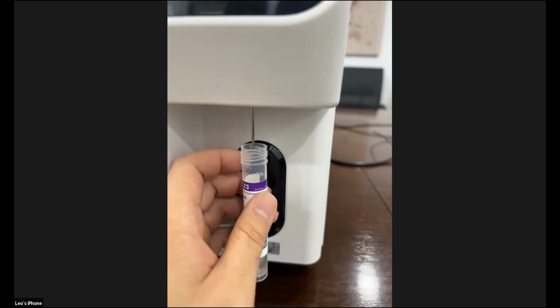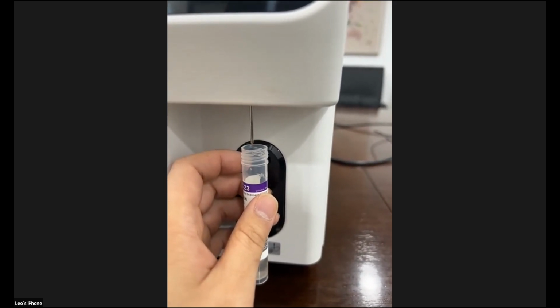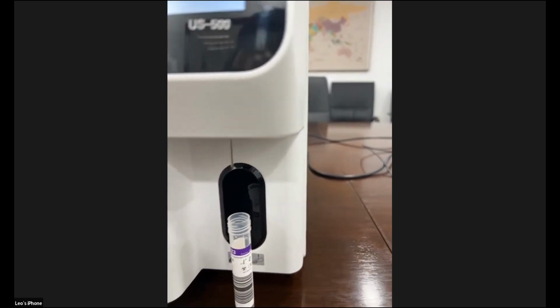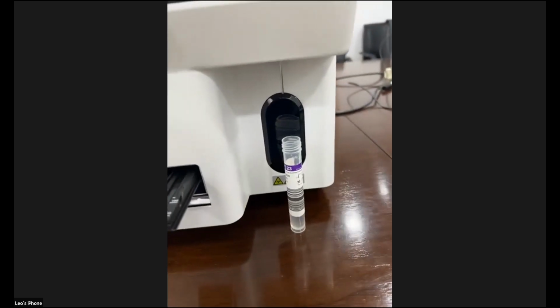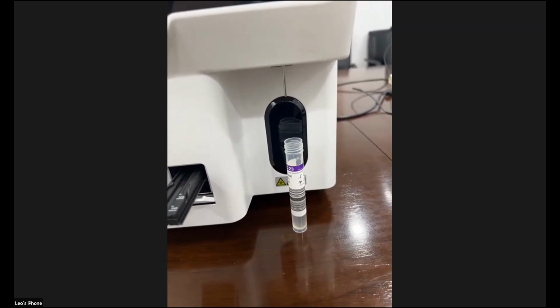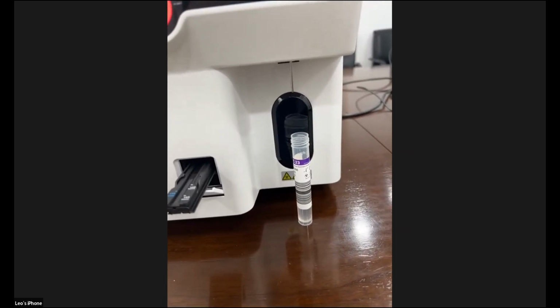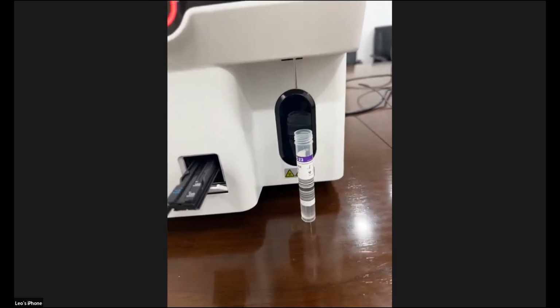Yes. One thing I want to know is, is it mandatory to shake the sample 5 times? Yes, because for sediment testing, the better we shake or mix, the better the result or pictures we can get.